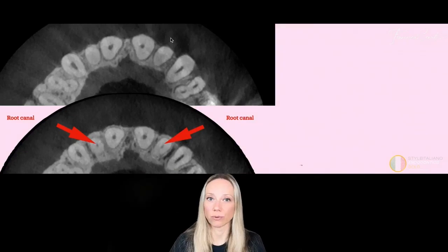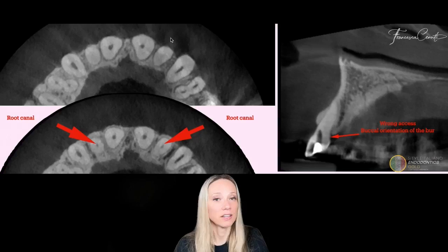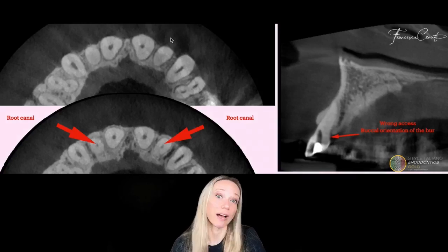And then after that, if you go more apical, you see that there still is a root canal, so I can treat the tooth. What do I have to do? I just have to correct the access cavity. And notice that when there is a wrong access cavity in an incisor, in general, its inclination is to buccal.